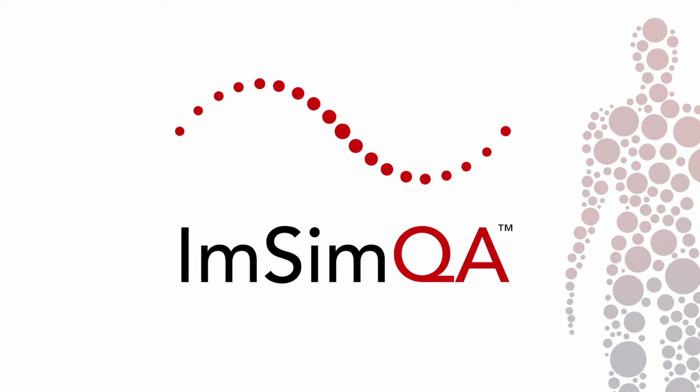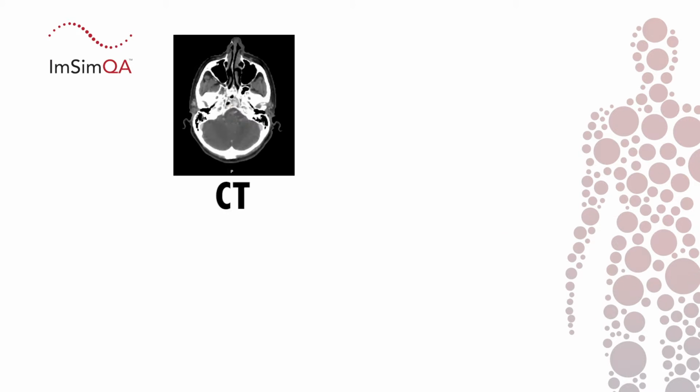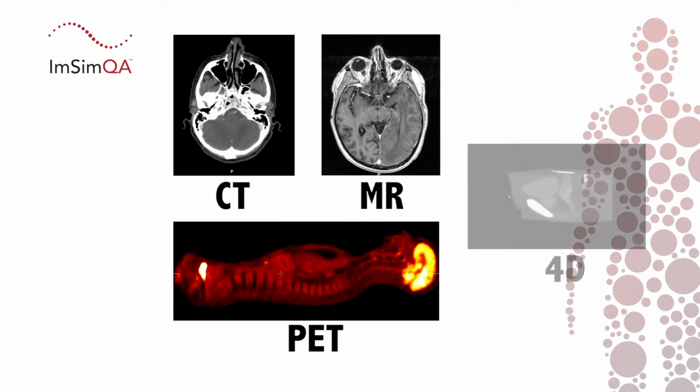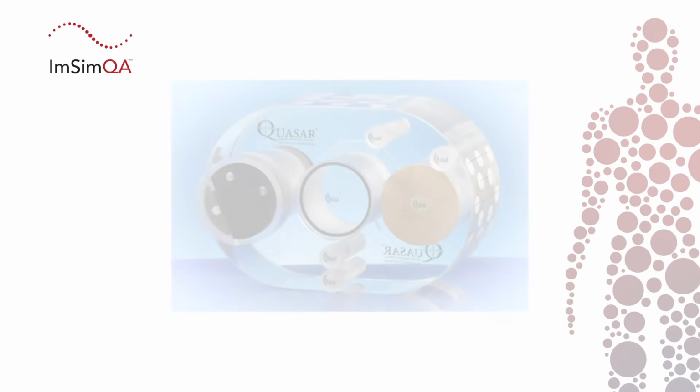ImSimQA is a software package that uses virtual phantoms for the quick, repeatable testing of deformable image registration in radiotherapy. It simulates CT, MR, PET and 4D. ImSimQA complements the use of traditional physical phantoms.